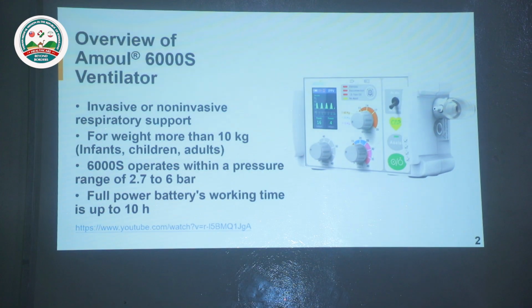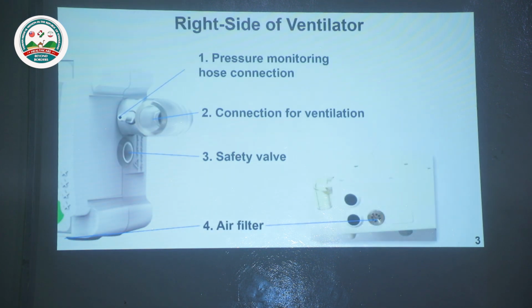Another thing is that this ventilator has a battery, and the battery capacity is up to 10 hours. But I need to mention that this means a new battery can operate for up to 10 hours. So if you use the ventilator several times and recharge again, the battery capacity could decrease. And next, I will focus on the hardware and then the software of this ventilator.